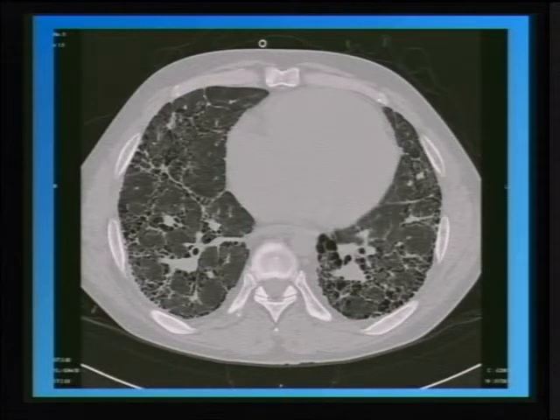Another area where interstitial lung disease gives you ground glass opacities is in a patient with pulmonary fibrosis. We can easily recognize pulmonary fibrosis when you have thickening of the interlobular septa. We can easily recognize pulmonary fibrosis when you see honeycombing. What's not very well appreciated is this diffuse increased opacity of the lung parenchyma overall, meaning again we have a very fine interstitial lung disease that's below the resolution of our scanner's capability. But what you see here is this remodeling of the architecture of the lung tissue and pulling and retracting of the vessels and the hila.